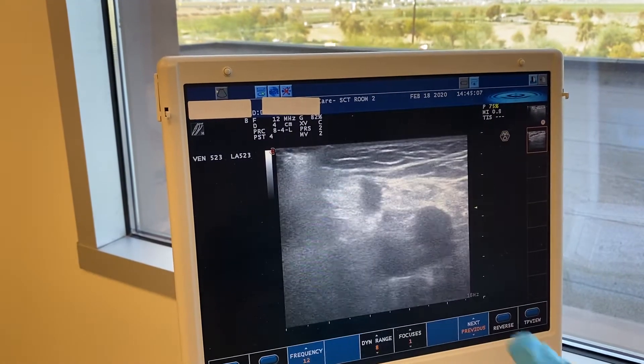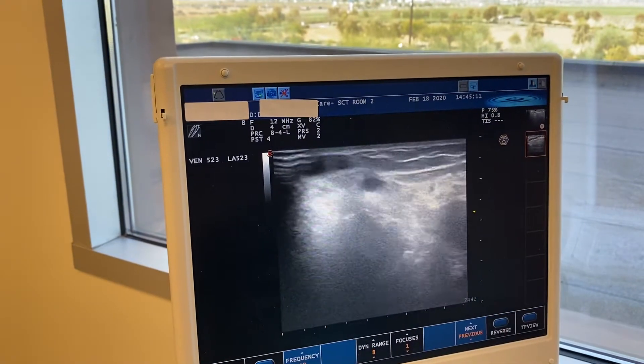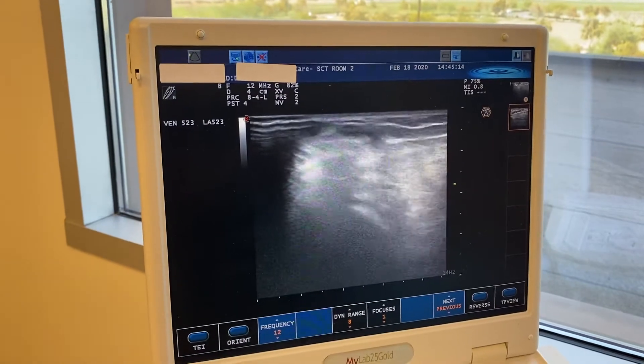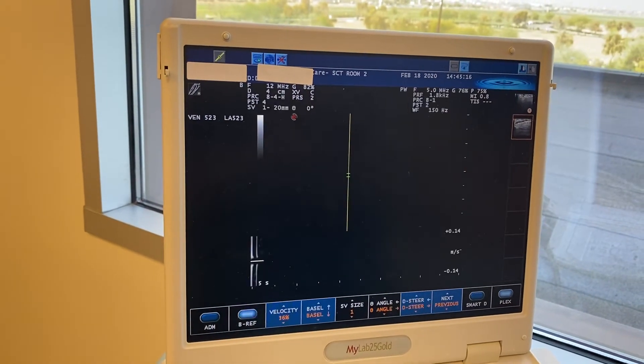Then you have this kind of tortuous vein that comes up — it never has a very long, straight segment to it, so it's always a little hard to treat. It comes up and feeds this vein here, and there's a lot of reflux. It's a fairly large vein.